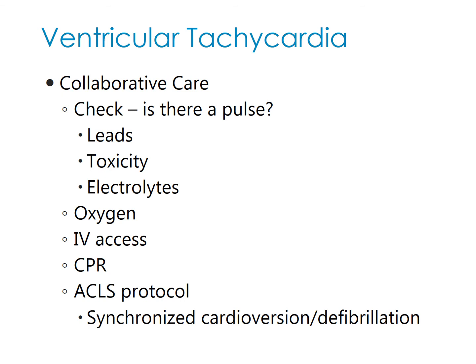Look at your client. They may be looking at you like, what's wrong with you? It just may be some weird thing where the leads are put on wrong, or they're moving, or something. I mean, that's probably not, but you always want to just make sure. Look at your client first. You're not treating the monitor, you're treating your client. Check your leads. Again, make sure the leads are all connected, they're in the right place.